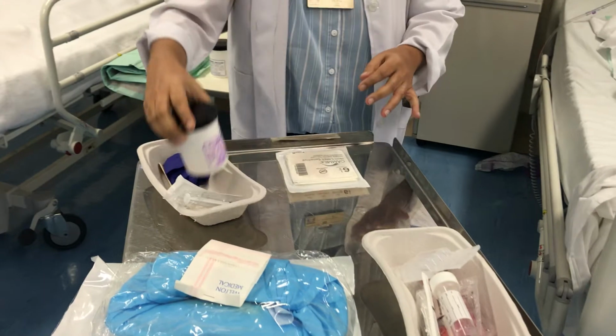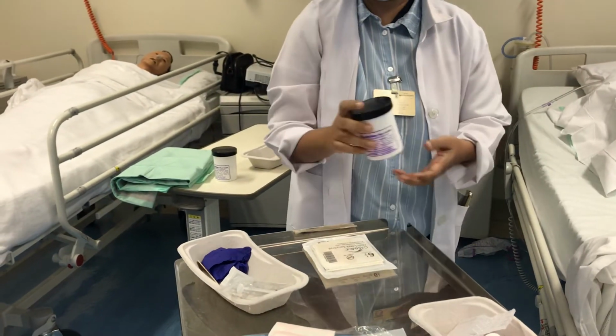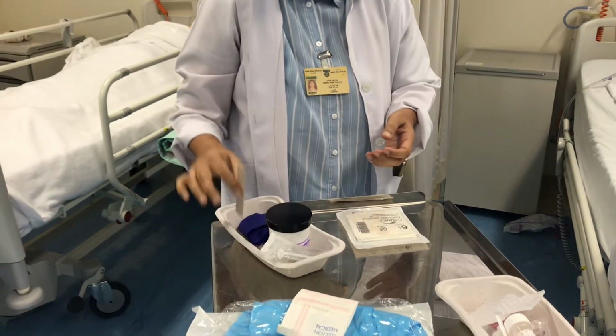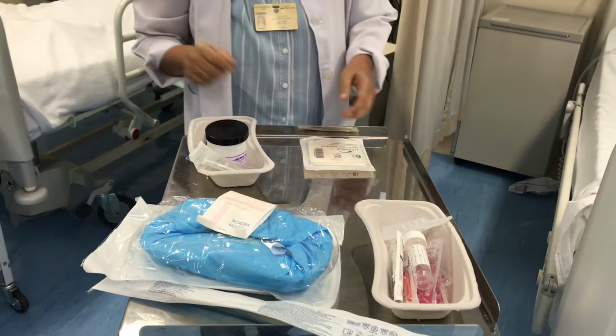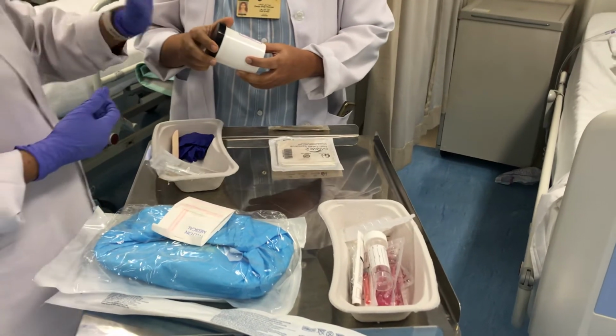Obviously we need the lubricant. Here the only available lubricant is this one. This is the lubricant that we are going to use, and we have the swab to take out the lubricant. Otherwise we will not get a sterile lubricant. We are not supposed to use this at all.